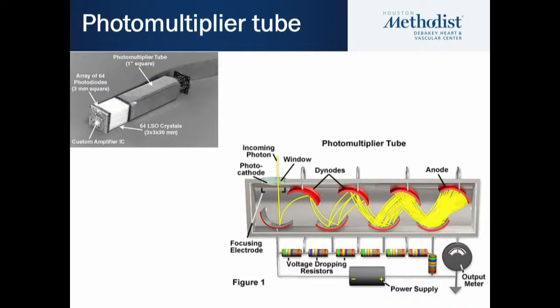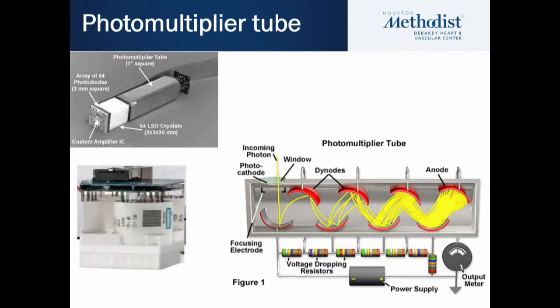Now, based on the time that you hit these detectors, it will say, well, I got a photon here and a photon here within nanoseconds. This is how sensitive these are. It has to be within nanoseconds. Then it will say, well, these are 2 real photons, and I'm going to assign a point in the middle where it came from.